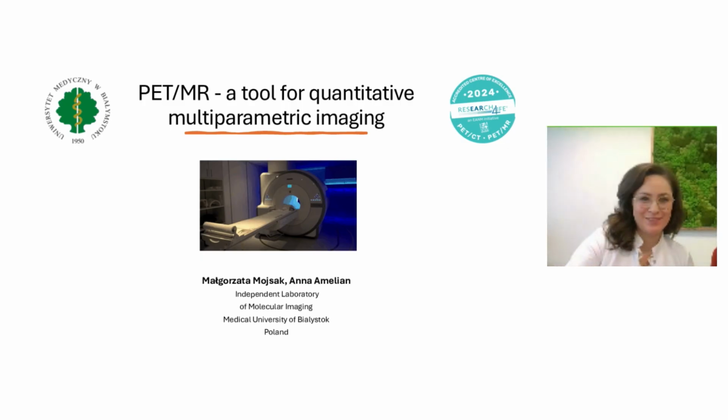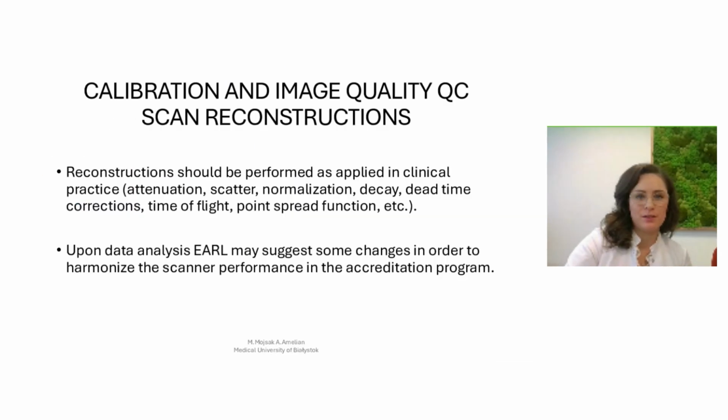Let's proceed with the lecture. You could see how to prepare the phantom. So it's quite a complex process when it comes to NEMA phantoms. The phantom is very well presented in this video.